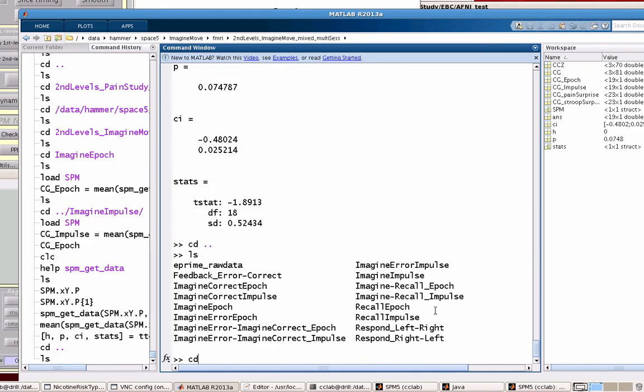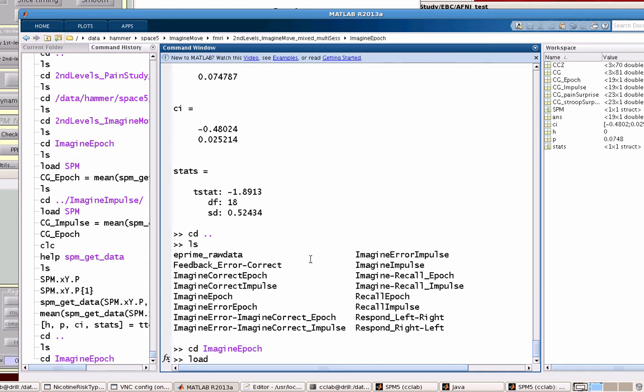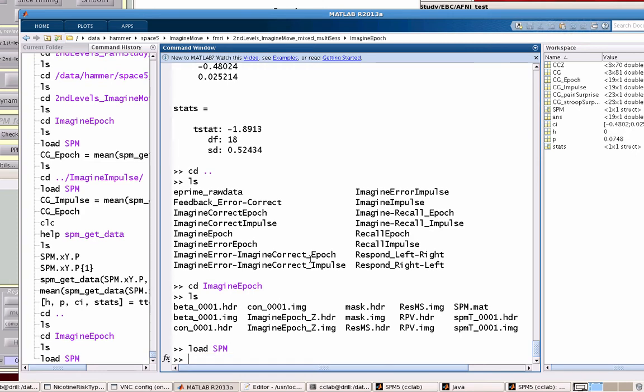The point is we can go into different second level contrasts. Let's say I go into a directory with a bunch of second level contrasts. Once I go into each of these, I can just load up those different SPM.mat files. This assumes you've run a second level analysis where you've selected all the different contrasts you want to go into this second level analysis.